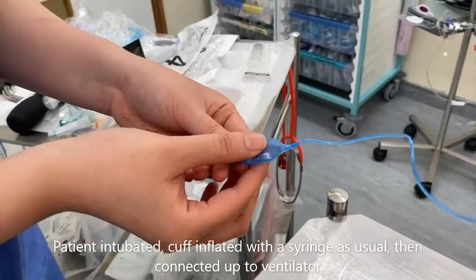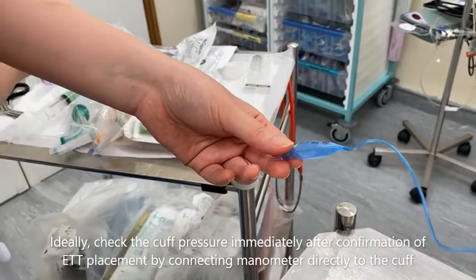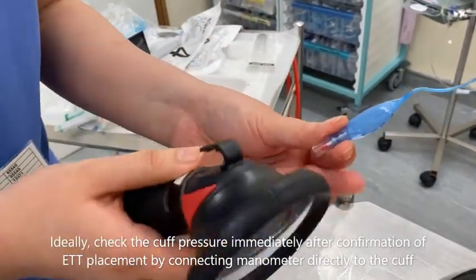After the endotracheal tube placement has been confirmed and the patient has been connected to the ventilator, attach the end of the pilot balloon to the lower lock of the manometer as shown.